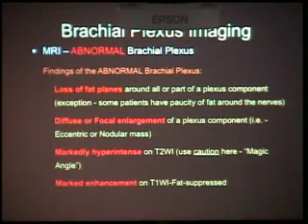So then we'll get into what the abnormal MRI findings look like. Fat is your friend. If you have blurring of that fat, could be edema, could be tumor. So if the fat looks clean, that's a good first step to think, all right, there might not be anything going on, but you typically rely more on your T2 images where you're looking for markedly hyperintense abnormalities and mass effect. Like with MR imaging in musculoskeletal radiology, you still can get that magic angle around 55 degrees. So you compare both sides to make sure that it's not artifact, that it is a real finding.